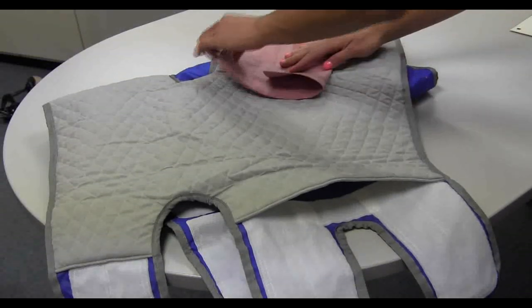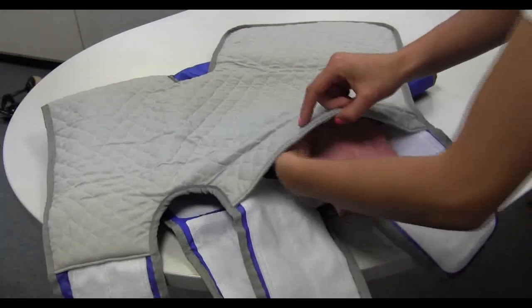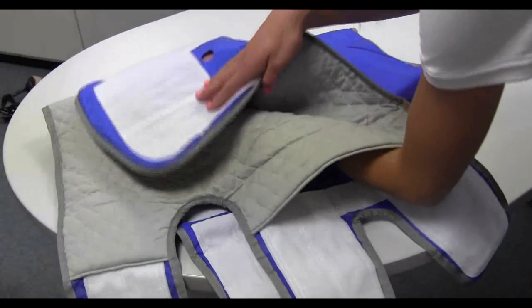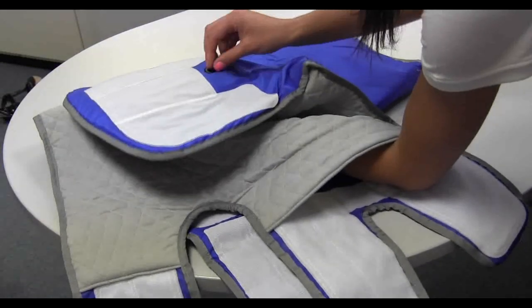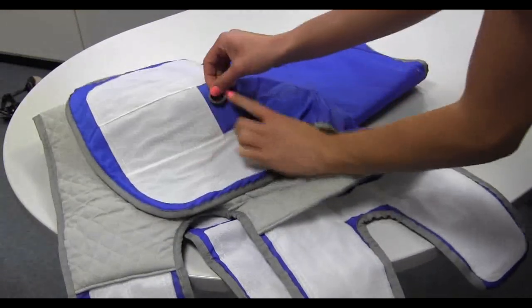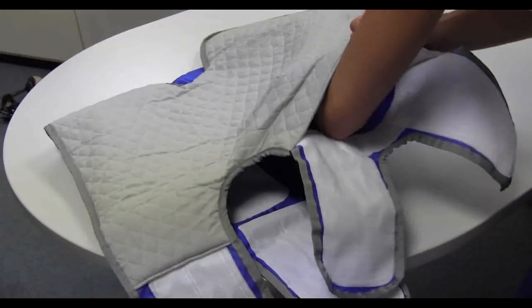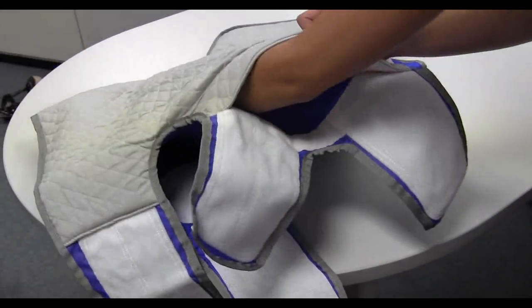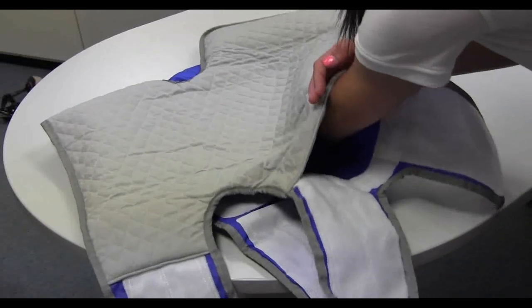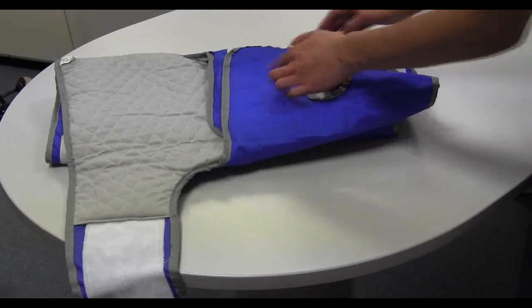Fold the lower thigh bladder into thirds. Insert the lower thigh bladder, making sure it remains lengthwise down the inside of the cuff. Push the bladder inlet through the cuff inlet opening. Fold out the bladder and flatten all bladders, making sure there are no wrinkles or creases. Thigh cuff assembly is now complete.